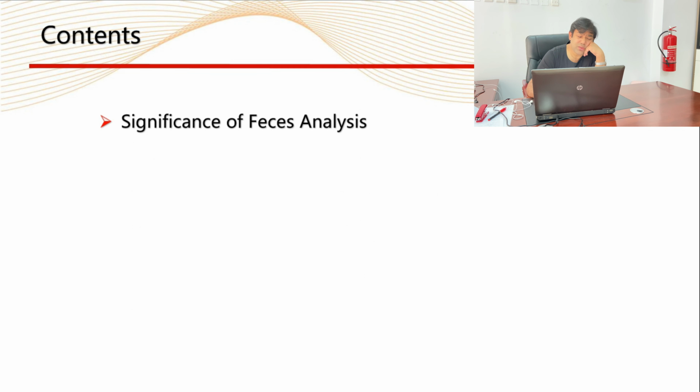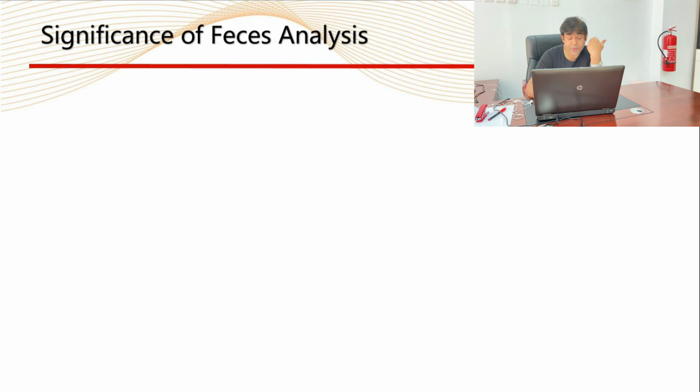This test we are using to diagnose the digestive function, especially pancreatic exocrine function, by observing sample color and consistency. Another purpose is to diagnose inflammation, bleeding or parasitic infection of digestive organs, and to determine if there is any intestinal infection disease by microscopic examination. And here we have the FOB test. Why are we using this FOB test? This FOB test is for screening of gastrointestinal tumor.